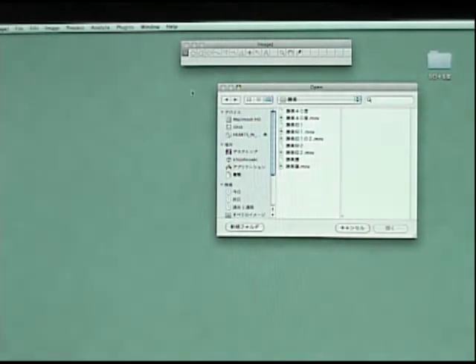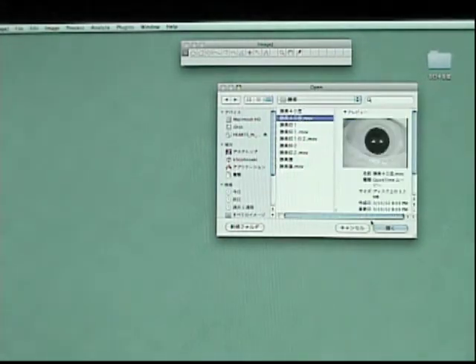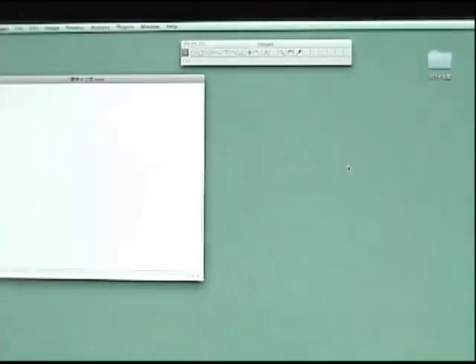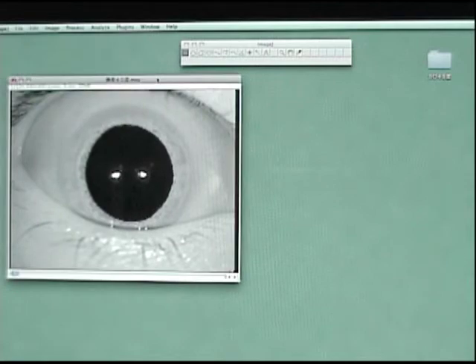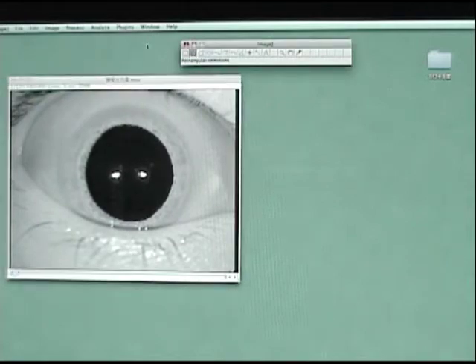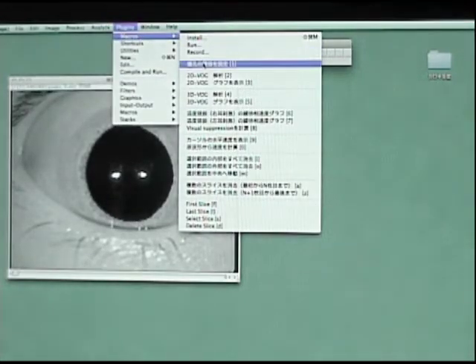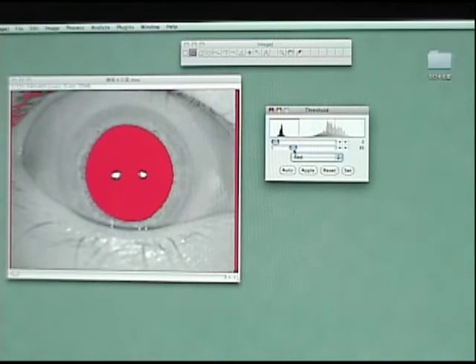Open the MOV file and convert to grayscale. And set the threshold. The pupil becomes red.